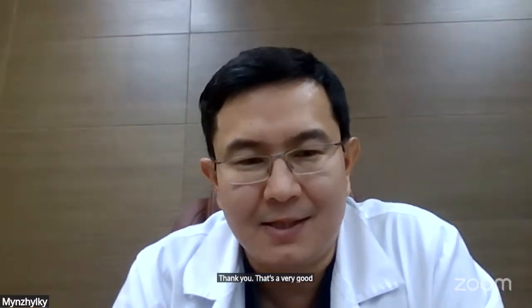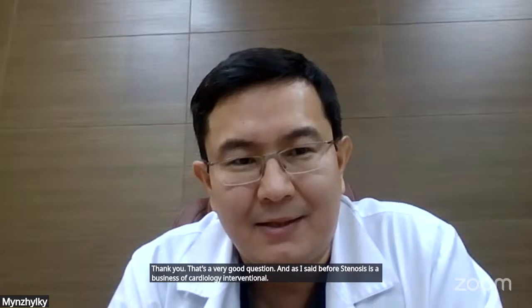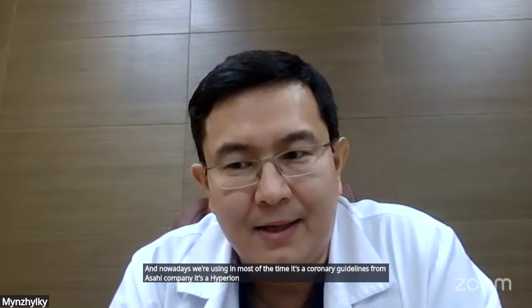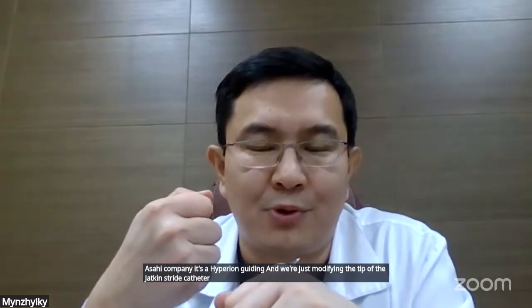Yes, thank you. That's a very good question. As I said before, stenosis is a business of interventional cardiology. Nowadays, most of the time we're using coronary guiding catheters from Asahi company, the Hyperion guiding catheter. We just modify the tip of the Judkins Right catheter, and it has very good support.